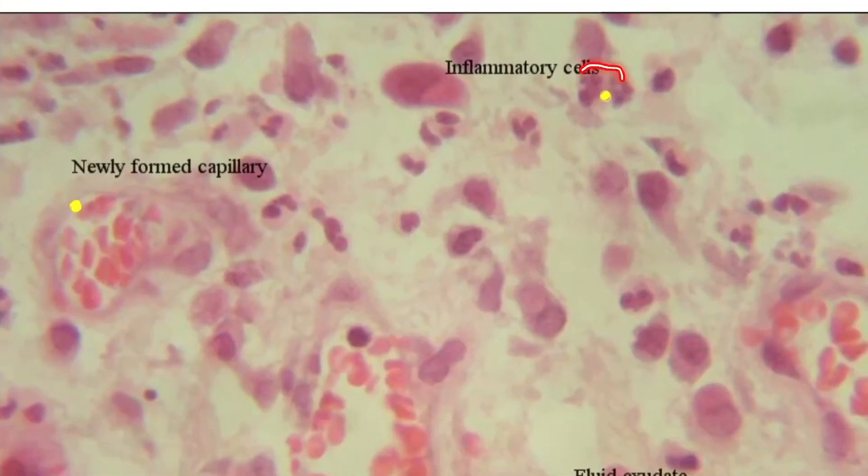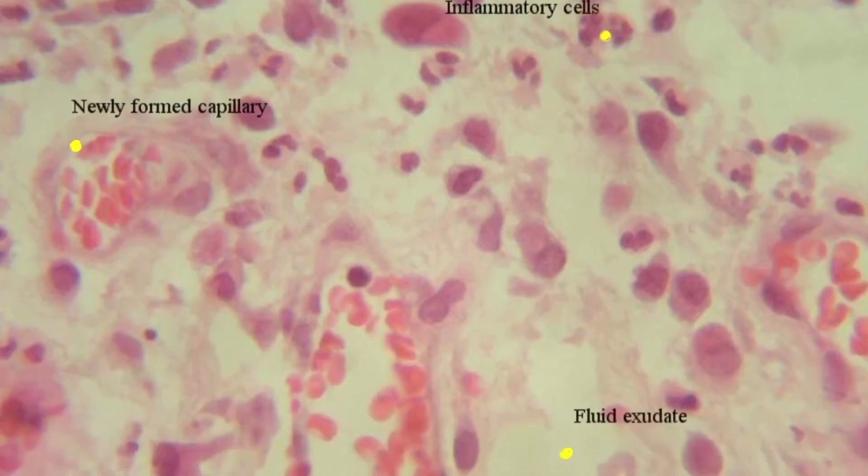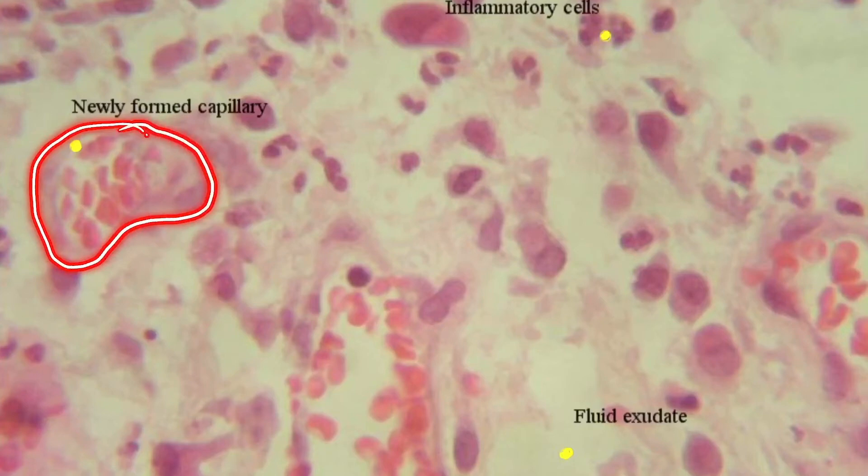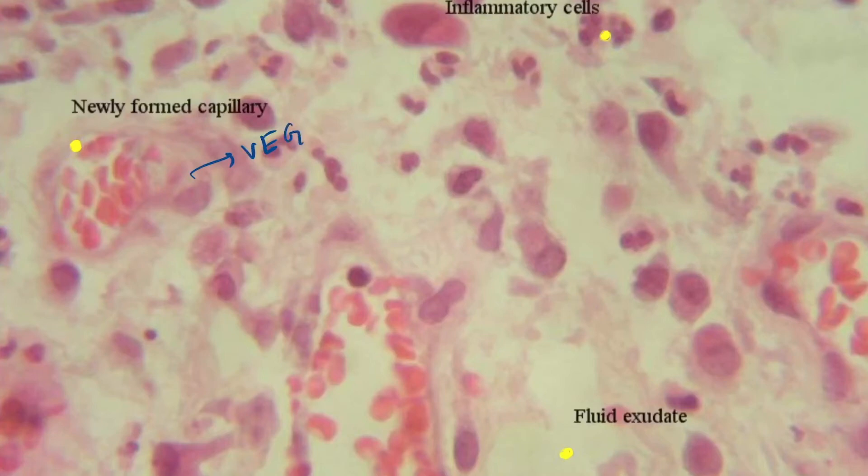First, you can see the inflammatory cells are there. There are newly formed capillaries, formed via VEGF—that is vascular endothelial growth factor.